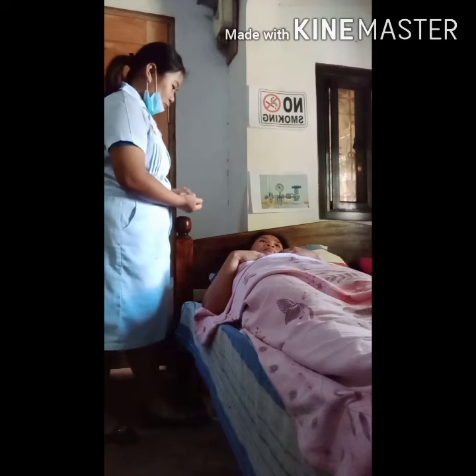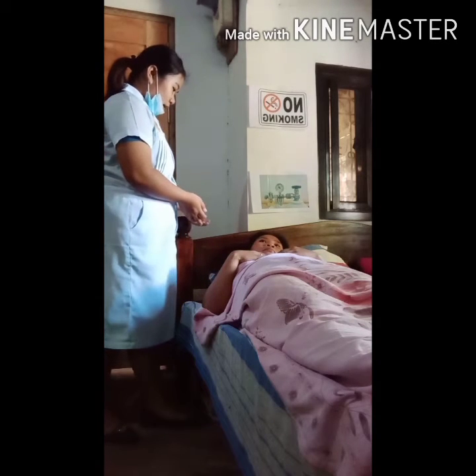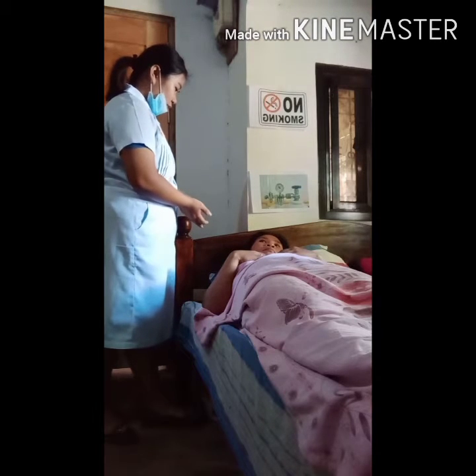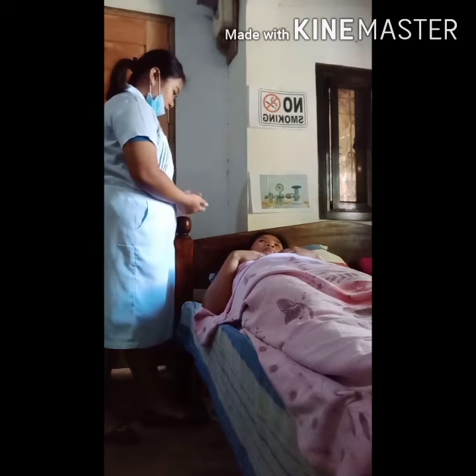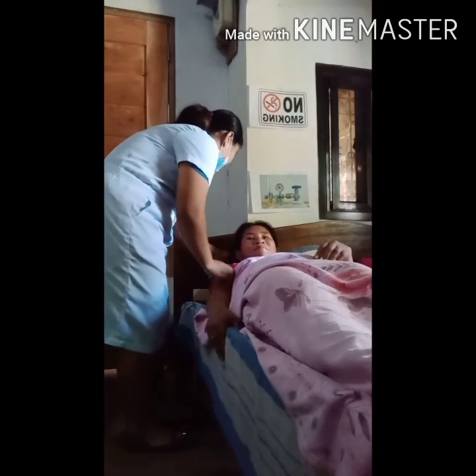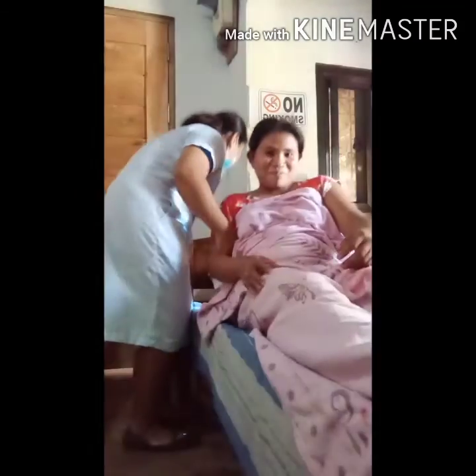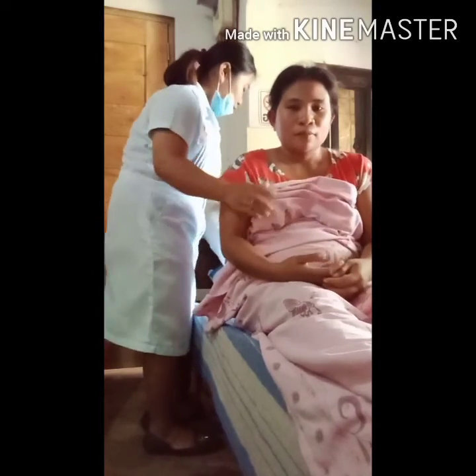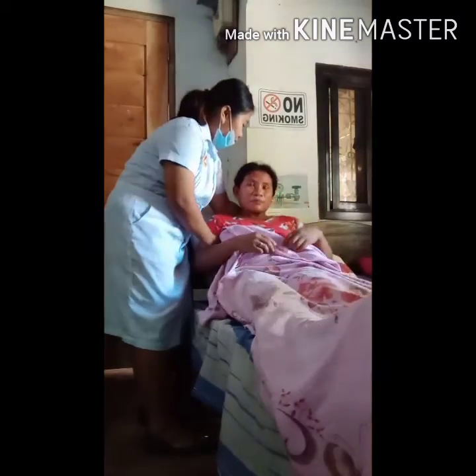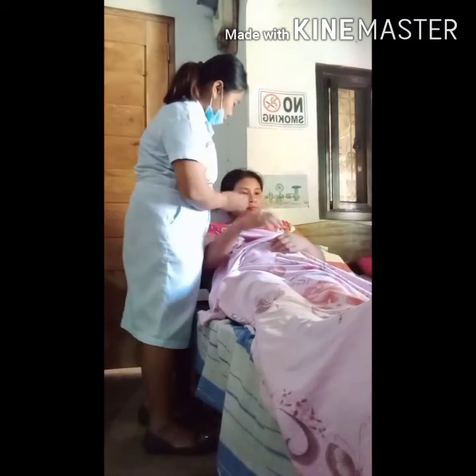So, ma'am, gusto nyo po bang ilagay ko po kayo sa semi or high Fowler position? Okay. Kailangan po. I-relax po natin yung ulo.